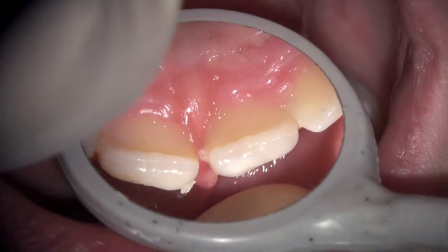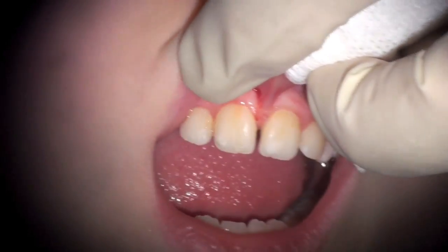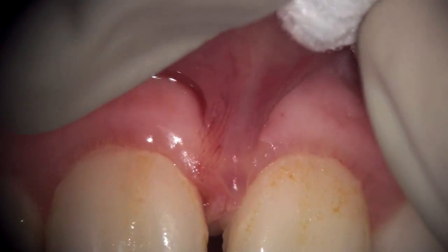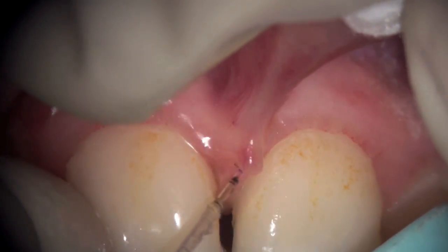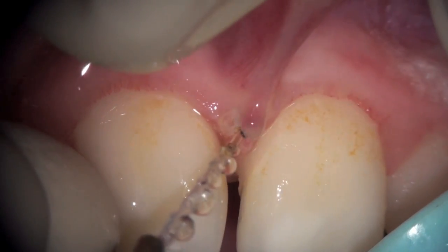This can be done at any time, both with the orthodontics or prior to the orthodontics. We see the diode laser now being used, and the tip is initiated — it's been properly cleaved and stripped. Now we're using a three-watt continuous wave with a fine stream of water blown on to cool the tissue initially.